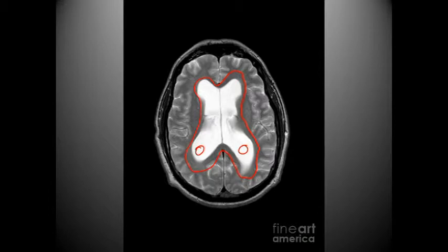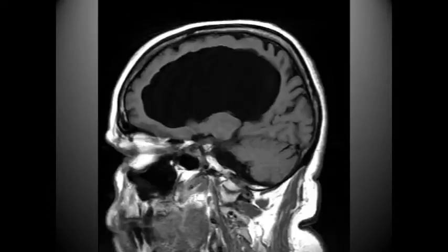The patient very well could be young and still have an appearance of being much older. Here is another example of hydrocephalus, and this is much more severe. We see that we have the lateral ventricle, and notice that there's really nothing but space in between this area of brain matter and around here.